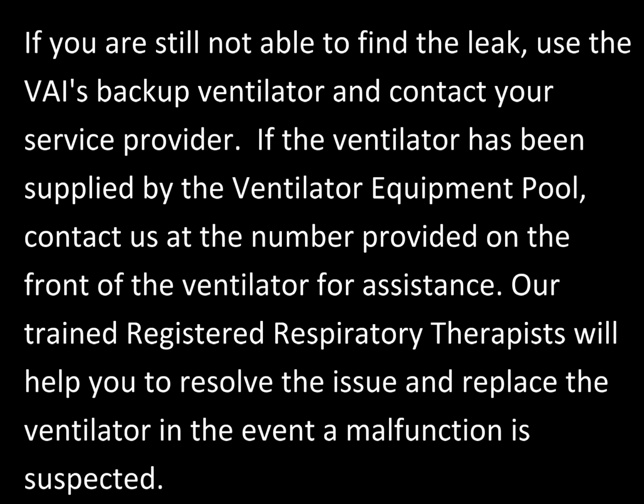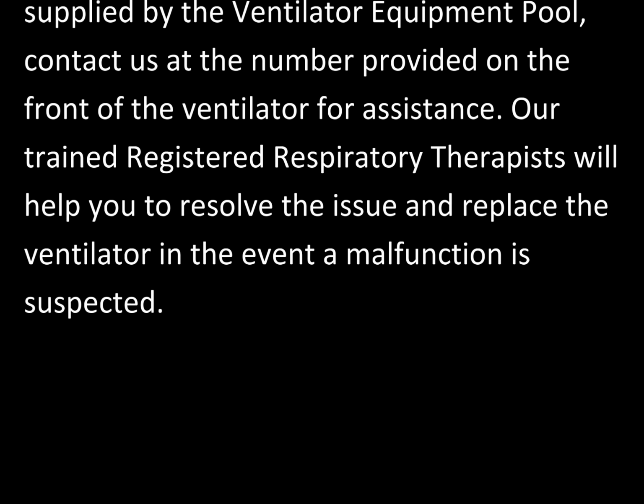If you are still not able to find the leak, use the ventilator-assisted individual's backup ventilator and contact your service provider. If the ventilator has been supplied by the ventilator equipment pool, contact us at the number provided on the front of the ventilator for assistance. Our trained registered respiratory therapists will help you to resolve the issue and replace the ventilator in the event a malfunction is suspected.